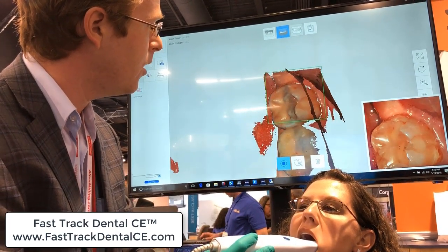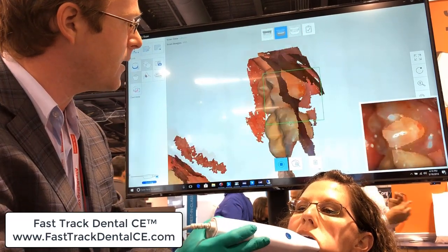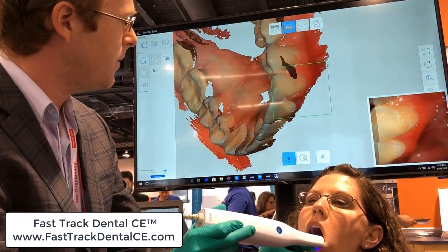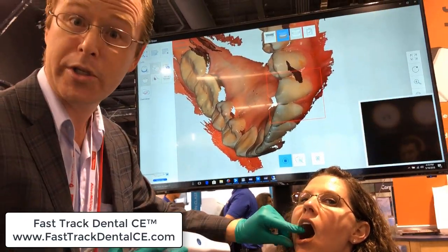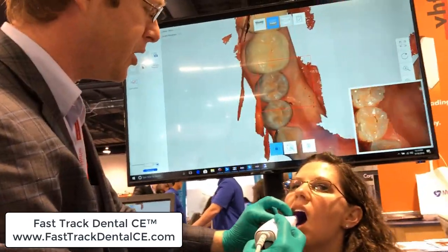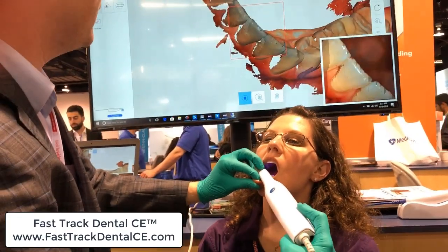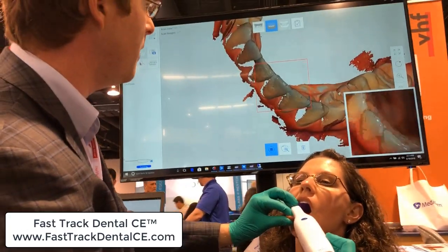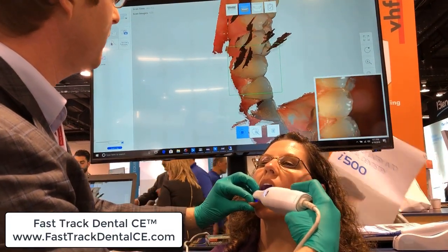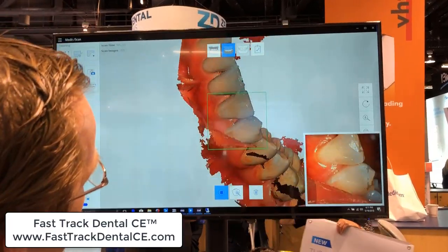I was a detractor too. I thought this thing scans so fast on a model, but let's throw it to the test. What better subject than somebody in your office — or better, worse, your wife? I've got just a couple of areas to touch up. Doing that here on the facial, sliding across — exact same scan strategy as I would use on my Trios — then picking up those little edges and sliding across.